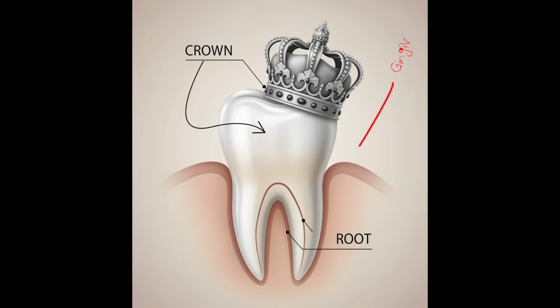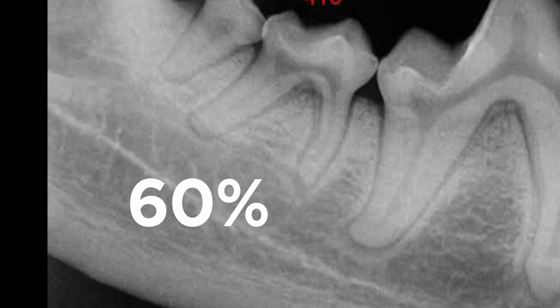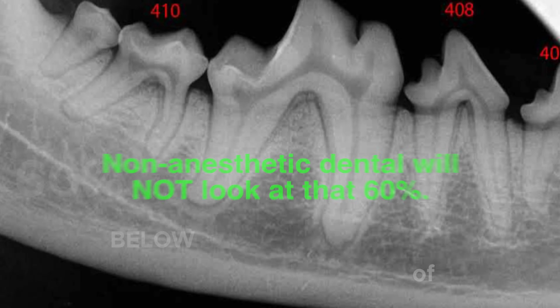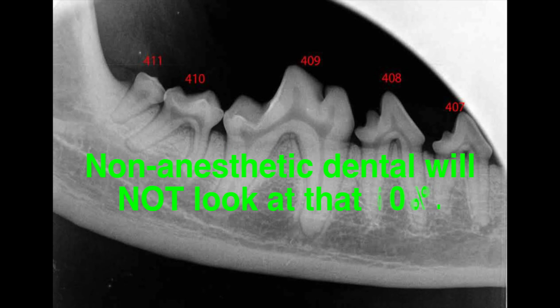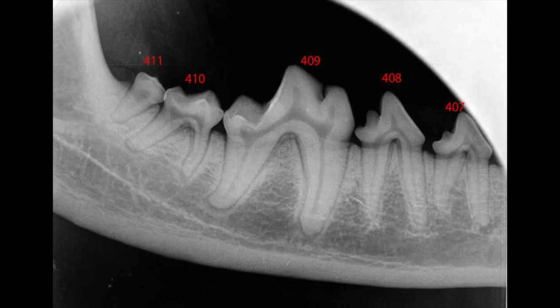The first thing to know is that dental disease happens below the gums. When a dog is awake, I can only tell you about the surface of the crown and the gingiva, but 60% of the tooth is below the gums. And a non-anesthetic dental will tell you nothing about that 60%. Only full mouth x-rays or CT scan will show you that 60%. Just because the teeth look fine, it does not mean that they are perfectly fine underneath.